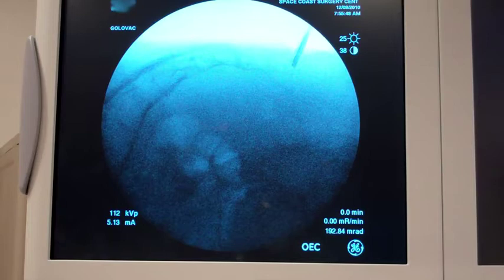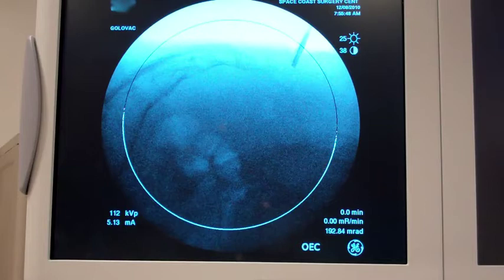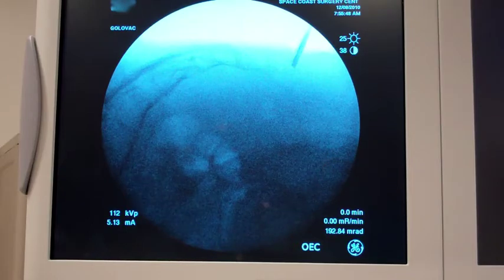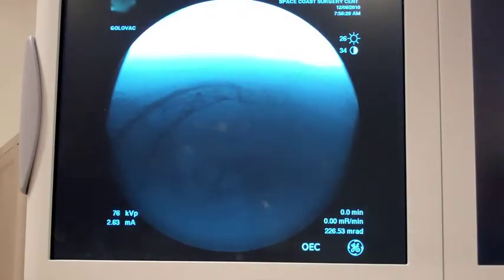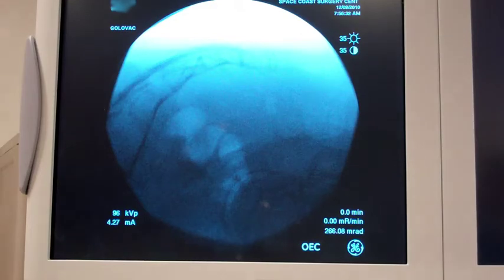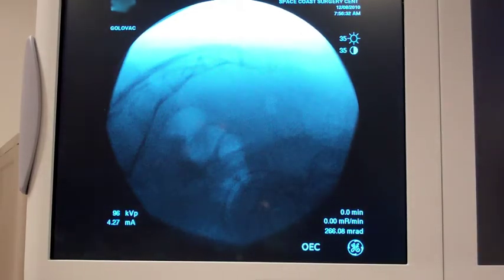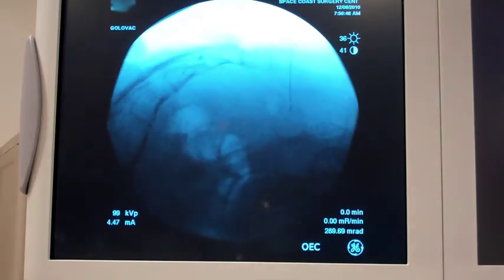Once there, we'll go ahead and inject the contrast medium of non-ionic medium — iso-vue 200, which is a myelographic component of contrast. Once we see the structure visually enhancing the area below the sacral coccygeal ligament, we'll then go ahead and inject the anesthetic, which is a combination of naropin and decadron. So here we go with needle placement, small pressure, and localizing itself underneath the fluoroscope. We want to make sure we get right underneath the sacral coccygeal junction.